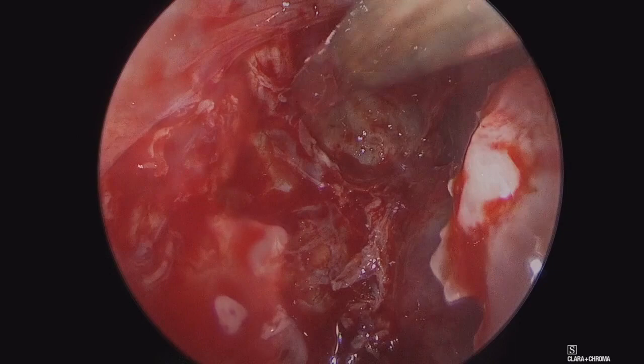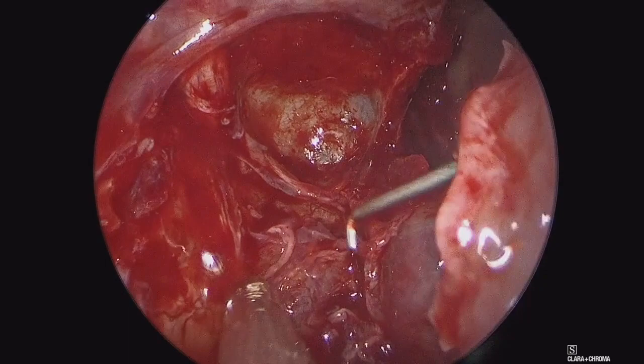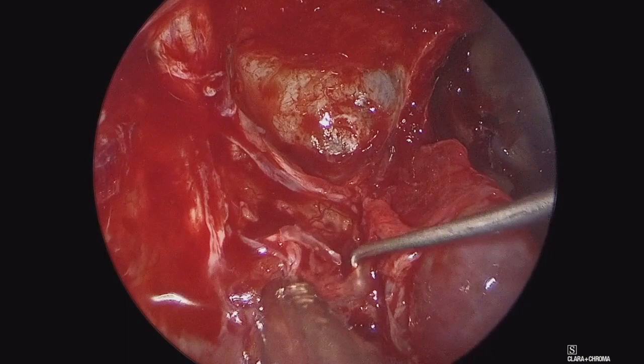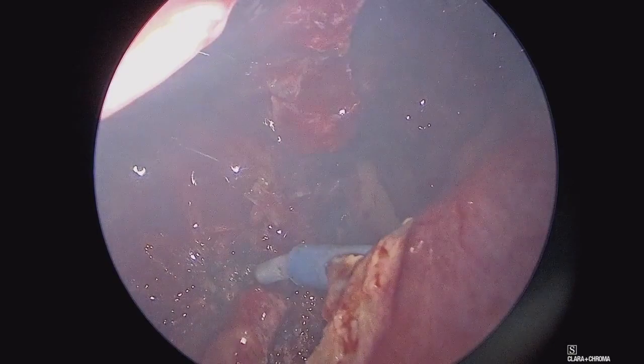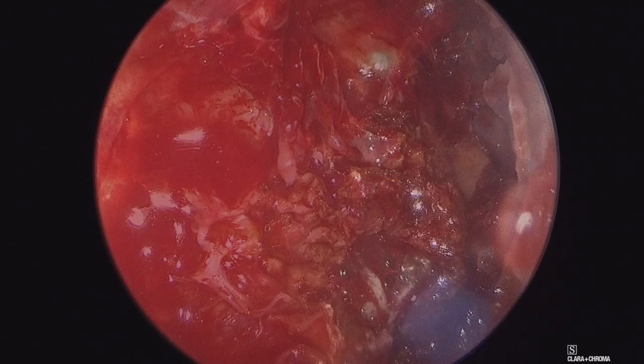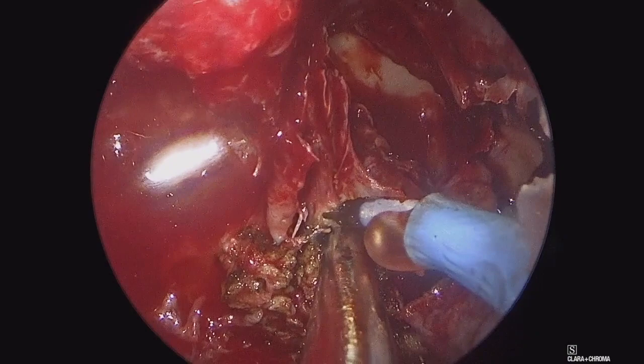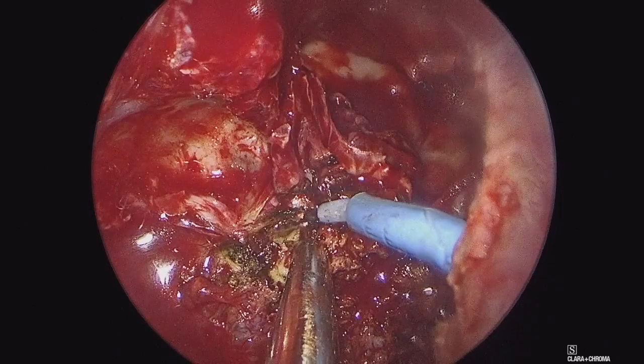Here we are isolating the nasal cavity portion of the tumor, where it originates from in the sphenopalatine foramen in the infratemporal fossa, and we'll go ahead and incise the periosteum of the pterygopalatine fossa. The pterygopalatine fossa is where the vast majority of these tumors arise from, getting their primary blood supply from the sphenopalatine artery, which is a branch of the internal maxillary artery — the terminal branch of the external carotid. We will sequentially dissect and remove this tumor, with the camera through the Caldwell-Luc and instrumentation through the nasal cavity, coagulating tumor as we work through the pterygopalatine fossa laterally towards the infratemporal fossa. It should be noted that occasionally these tumors have direct blood supply from the internal carotid artery, typically from the vidian artery or the artery of the pterygoid canal.